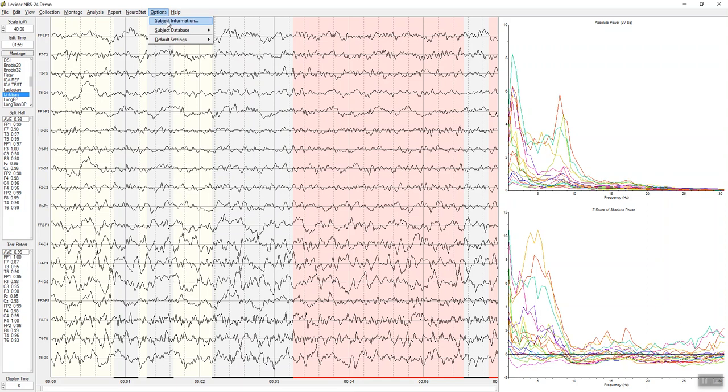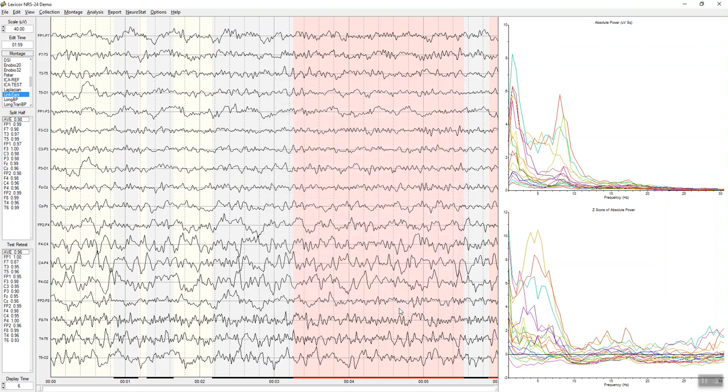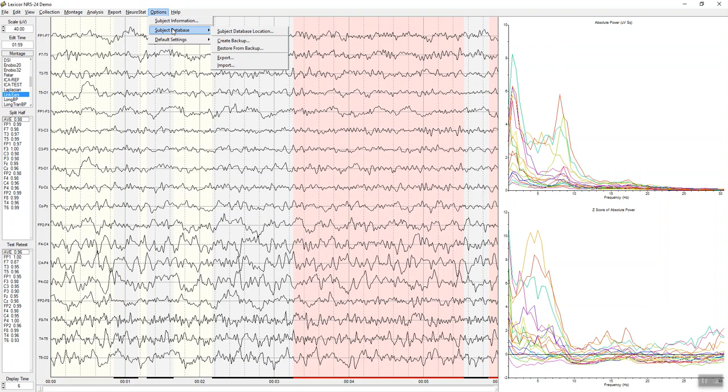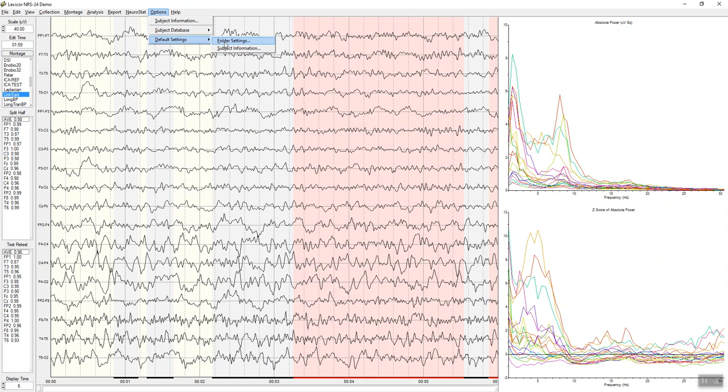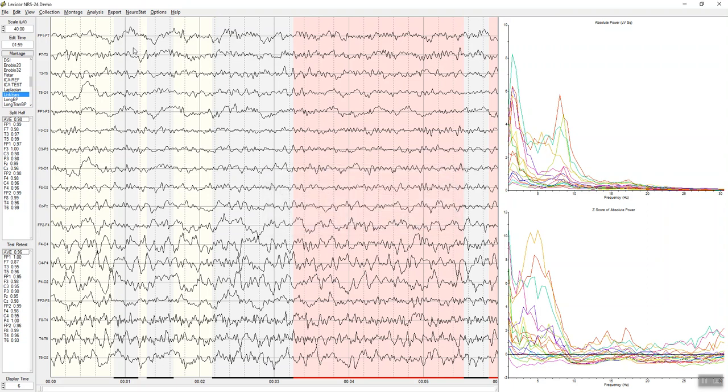Under options, there's the subject information. Right now there's not a lot in there because this is a demo, but you want to put in comments, medication, a lot of information in here because all of that will be used in the automatic clinic report. You also can export your data to a subject database, back that database up, restore it from backup. That way you can keep track of your patients efficiently in a database. And then default settings to allow you to always navigate to where you want to go efficiently, where you want to go to the patient's folder or a particular folder that has all of your patient data.